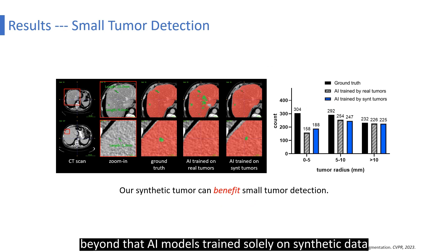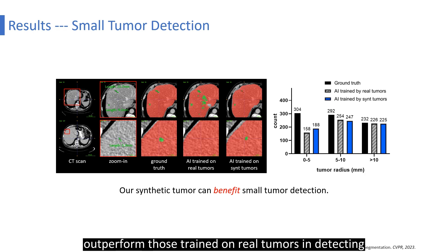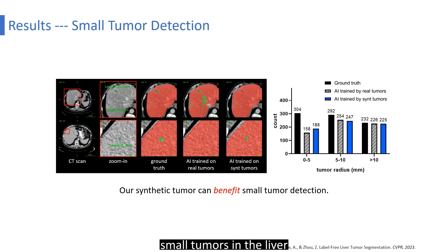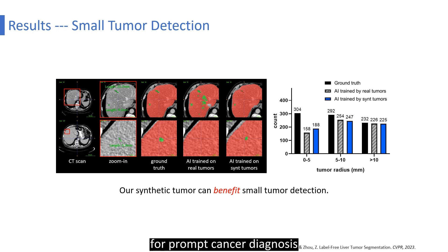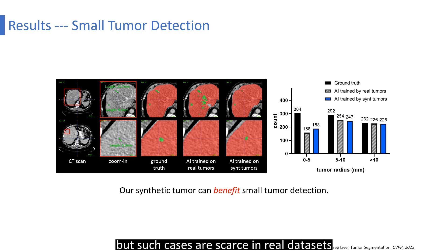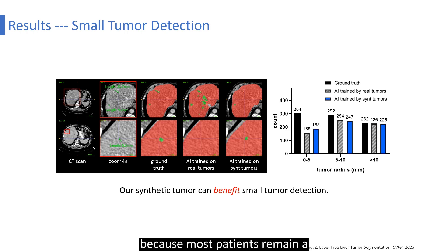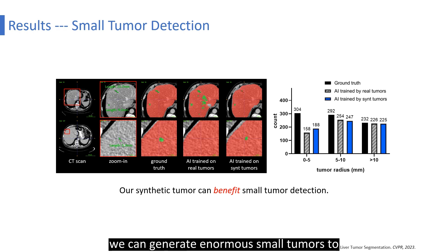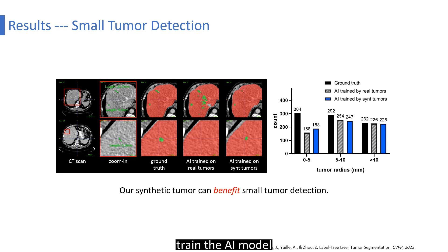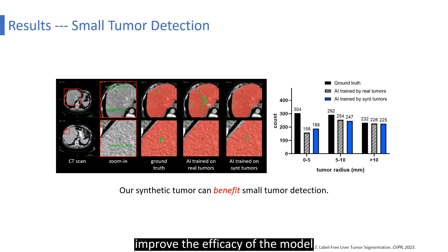Beyond that, AI models trained solely on synthetic data outperform those trained on real tumors in detecting small tumors in the liver. This is important because early detection of small tumors is essential for prompt cancer diagnosis, but such cases are scarce in real datasets because most patients remain asymptomatic during early stages. Using synthetic tumors, we can generate enormous numbers of small tumors to train the AI model and therefore improve the efficacy of the model in detecting real small tumors.